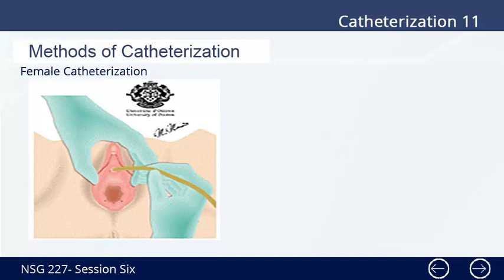Eases the catheter insertion. Female urethra is about 3.7 to 6.2 centimeters long. Urine returns demonstrate that catheter is properly positioned. Further insertion ensures that balloon is well inside the bladder and not in the urethra. 21. Hold the catheter securely with the non-dominant hand while the bladder empties.